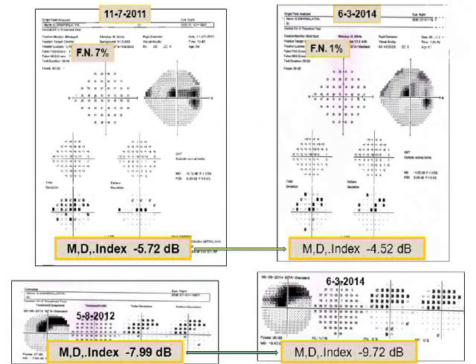In 24-2, the mean deviation, there is no change. Actually, this mean deviation is 5, with false negatives 7. When the false negatives became 1, the mean deviation actually became good. So almost there is no progression in the 24-2.